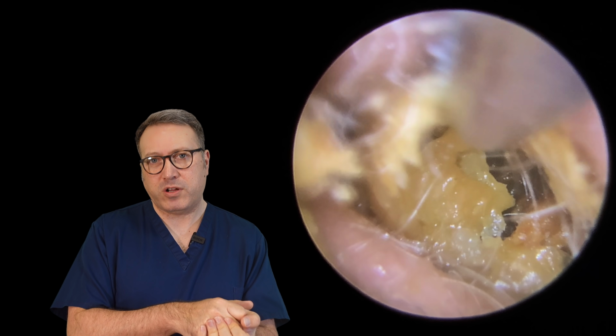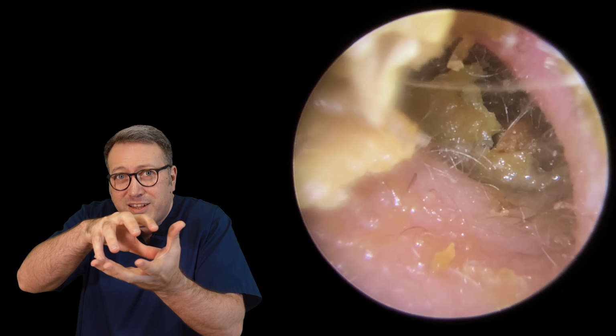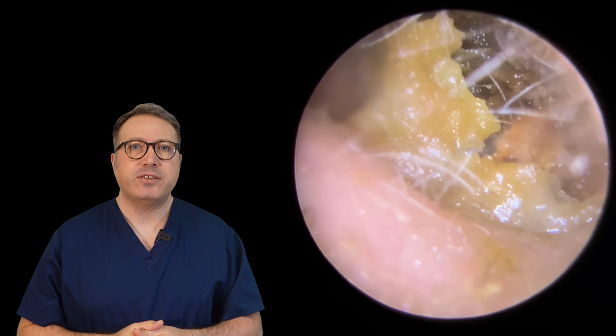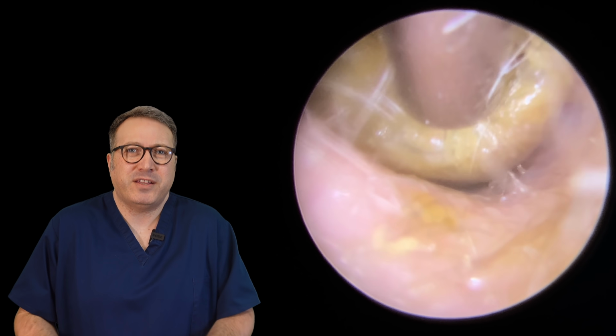We've gone back to the crocodile forceps now. Got a good grip on the top. Look, as we pull this, look at that layer of skin coming. It's sliding off the top of that wax there. So we're going to get this left-hand side canal wall here and the bottom. We're just going to start lifting this away as well.